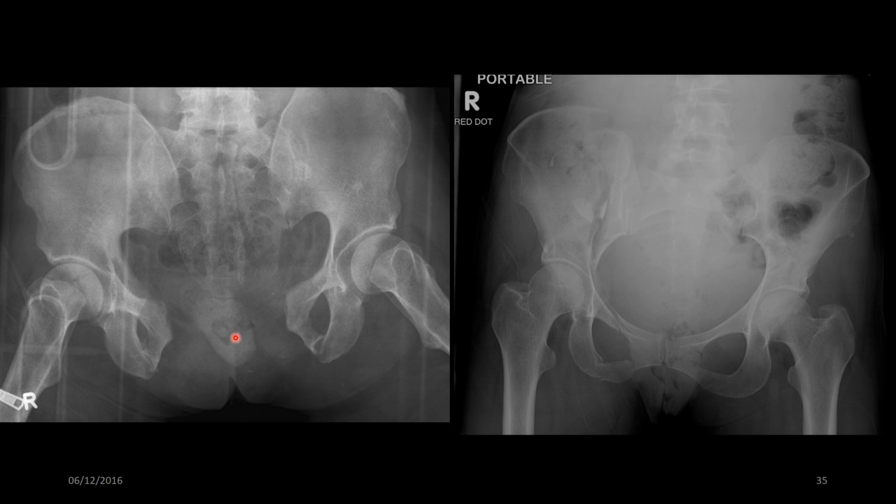Now here you can see that they've got a massive open book fracture, whereas you've missed off the crest here. That open book fracture is probably of more concern than any injury to the crest. But here you've got an injury to the right hemipelvis or the iliac crest, which runs straight down here and through here. This is the pubic ramus, and there's a fracture through there, as well as a fracture right down the right hemipelvis, and that gives you an example of the importance of why we have to get the crests on, and also some examples of why we can do certain examinations portably.